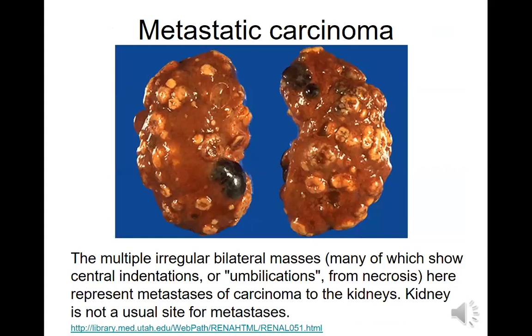How do I know that? I don't. But if you see this, and these don't look like cysts, obviously, this is necrotic tissue. Again, to find out if it's metastasis rather than primary carcinoma, you would have to do the genetics of the cells that are in these tumors to see where they would come from.